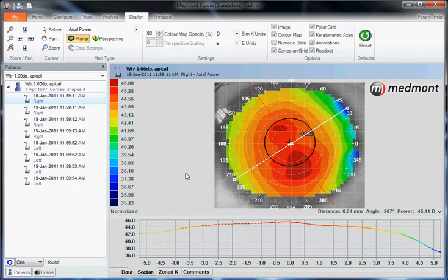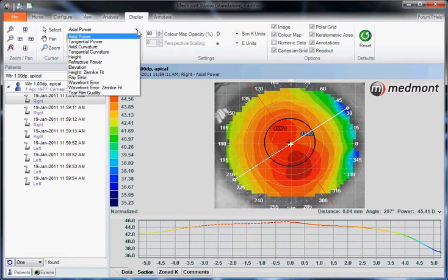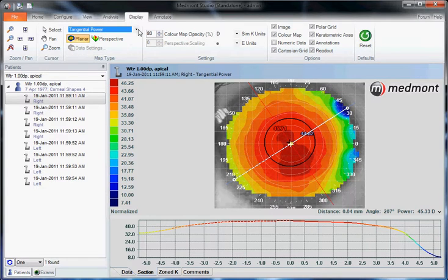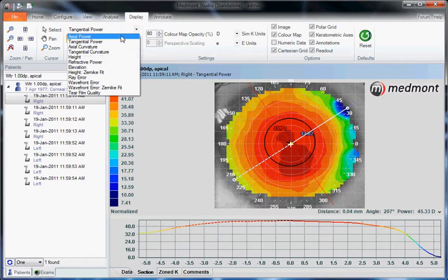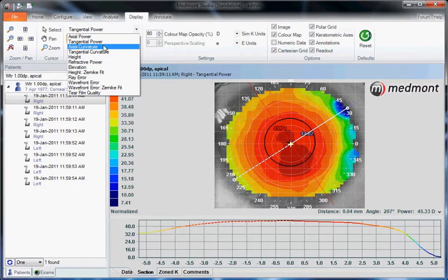For instance, if you want to change from an axial interpretation to a tangential interpretation, we can do that here. We can select any of the different analysis options.